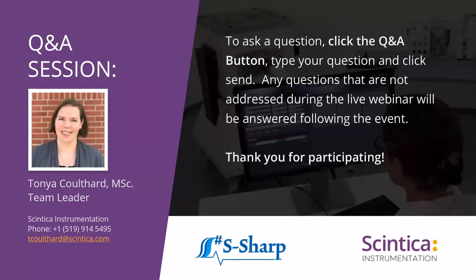Great. Okay, and do we have time for one more? What do you think? I think we do. I'm just scanning through to pick one out.